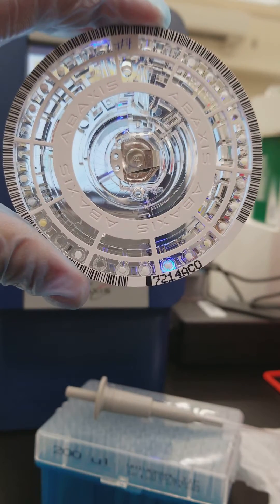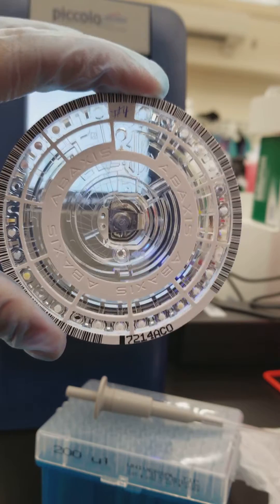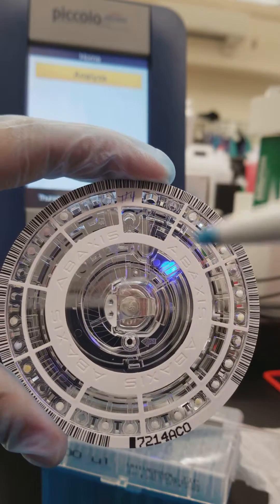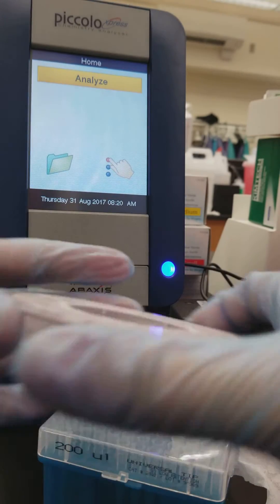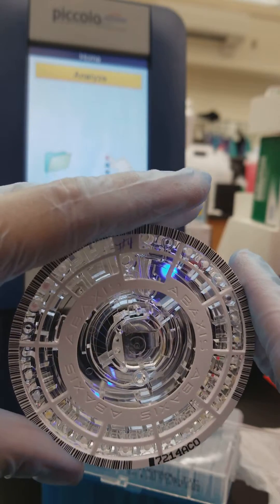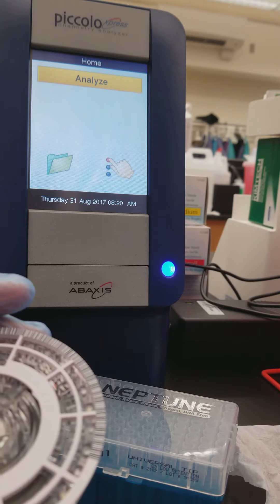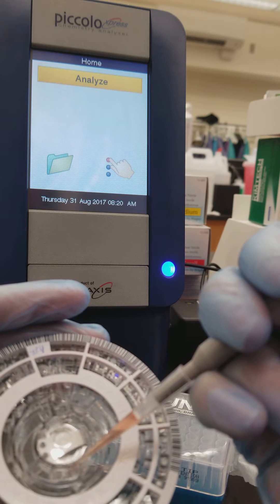This is what it looks like without having added any specimen — notice the window is completely clear. This is the fill window and this is the fill line. Inside there is also diluent. When the specimen gets put on and it spins, it will automatically do dilutions to make sure your result is going to be measurable and able to be reported out. If the result is too high, it will have an asterisk next to it.